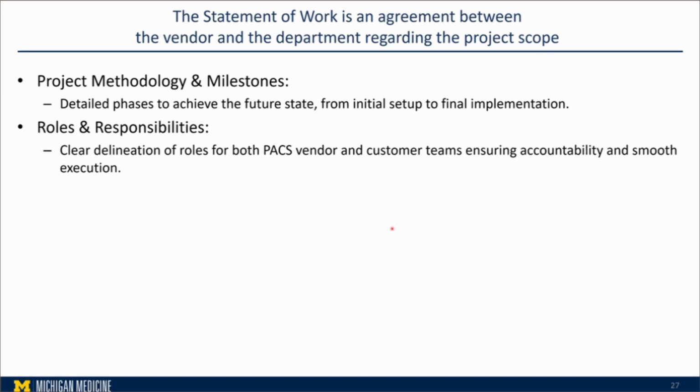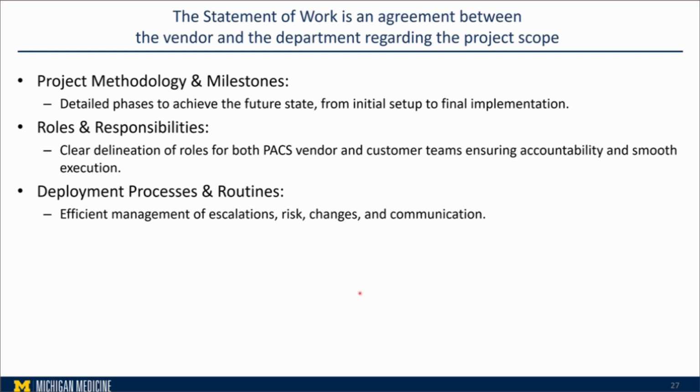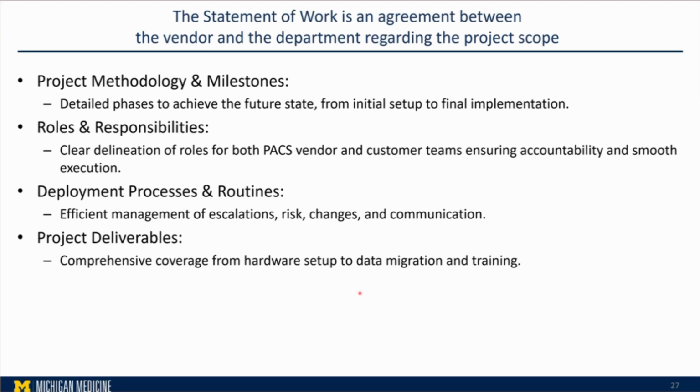Roles and responsibilities: I'm going to share with you also what's called a RACI chart, and why it's really important. You need to have a really clear delineation between the roles from both the image management system or PACS vendor as well as your team. Deployment and processing of the routine: make sure that you have a way of escalations, risks, and a great way of communications.